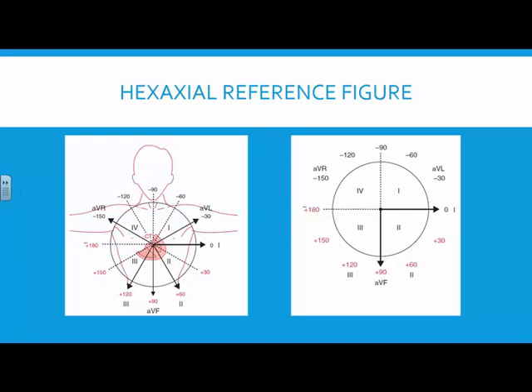I'm going to have a P wave, which is going to be positive, right? All right. So there's the start of my P wave. That ain't the greatest here. All right. But then, for a very, very small, incomprehensible amount of time, there's not really a whole lot of electrical current going on because it's being held up at the AV node, which is going to give us this little section right here, right? Okay?